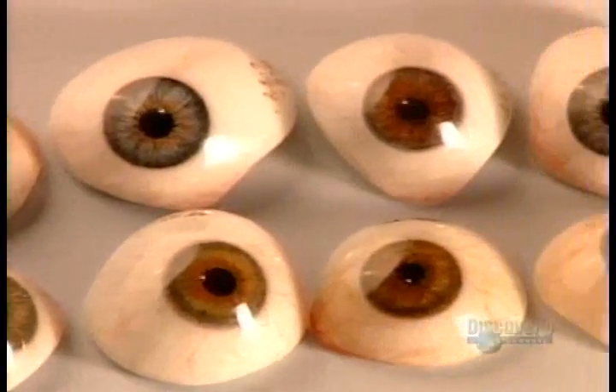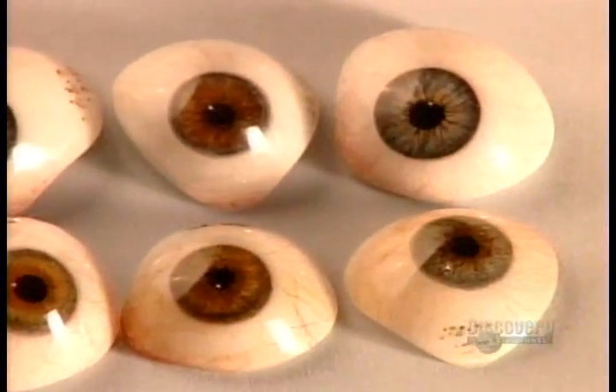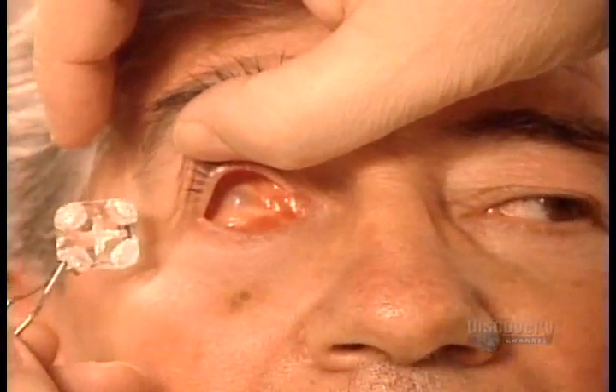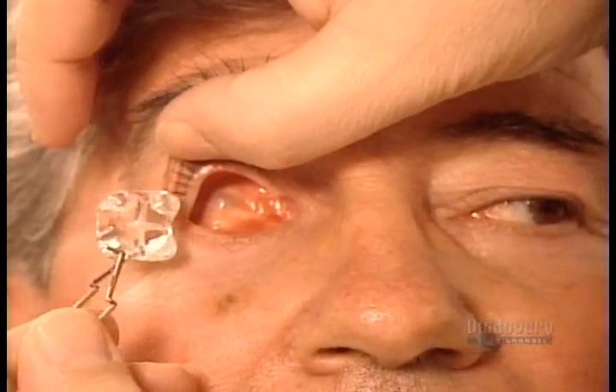If you've lost an eye in an accident or to a disease, a specialist known as an ocularist can fit you with an artificial eye. You can get a ready-made model or a custom-made prosthesis, like the one for which this patient is being fitted.